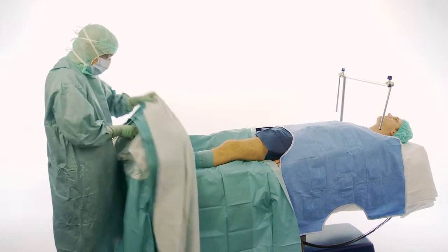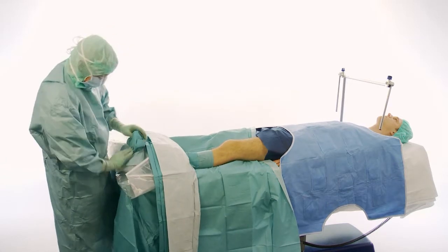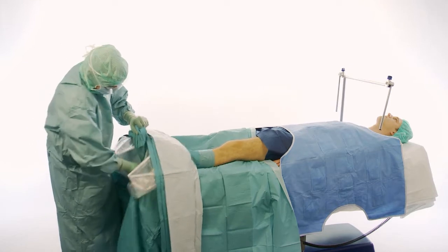Reach through the elastic opening. Grasp the patient's foot and pull it through the drape.